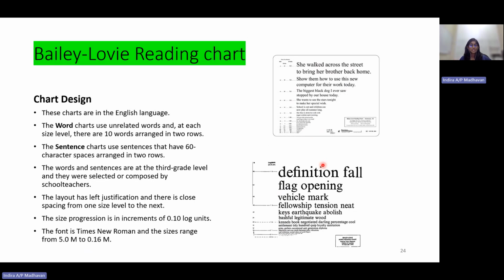So it is actually a very systematic chart and also very comprehensive, because the size of the letters, the choice of the letters, the spacing between the letters, the character space between the letters and words are systematic, or constant.